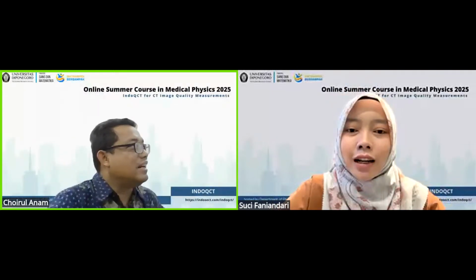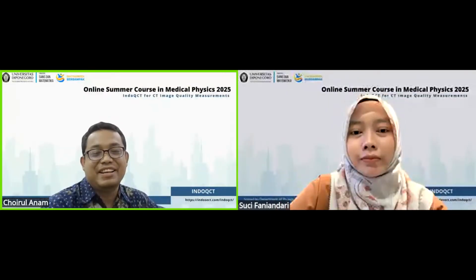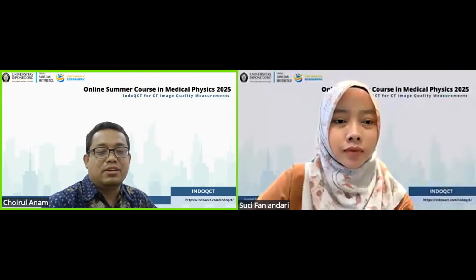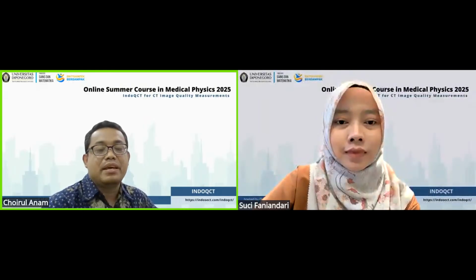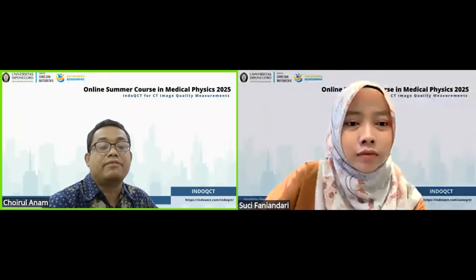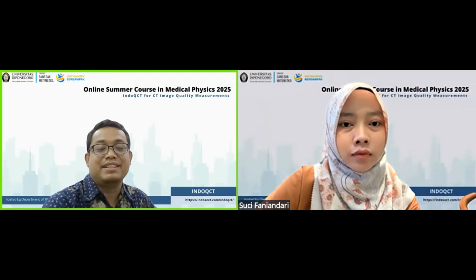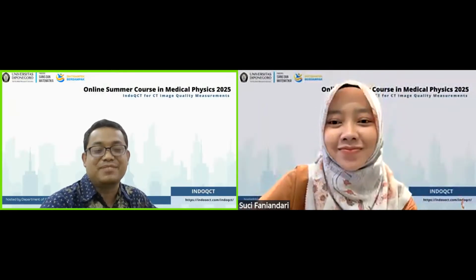It depends on our country. In Indonesia, we only measure the noise level. But in America, for example, you need to measure noise level, noise uniformity, noise homogeneity, and also the peak frequency of the noise, and also the average frequency, or mean frequency. So it depends on our country, our regulatory body. Indonesia is very simple: only the noise level and noise uniformity is enough.